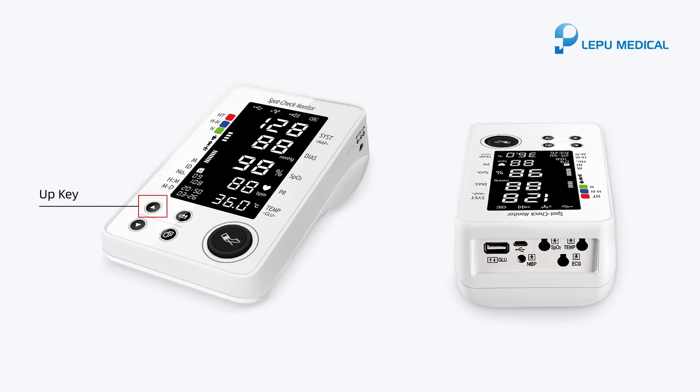Up key. Down key. Memory key. Menu key. Start/Cancel button. Power button. Power port. Glucose meter connector. Charge/USB data interface. NIBP cuff connector. Smart SPO2 probe connector. Easy ECG monitor connector. Temperature probe connector.